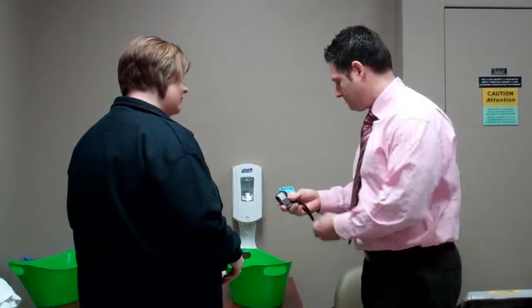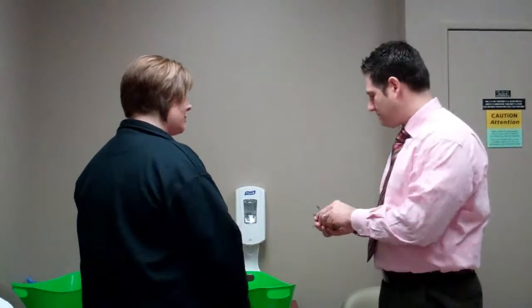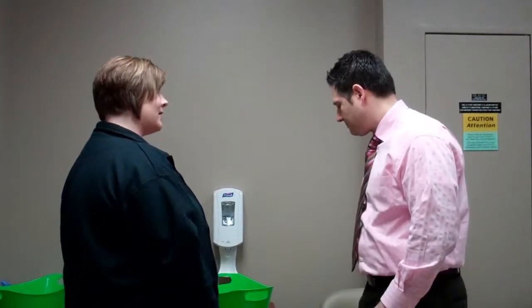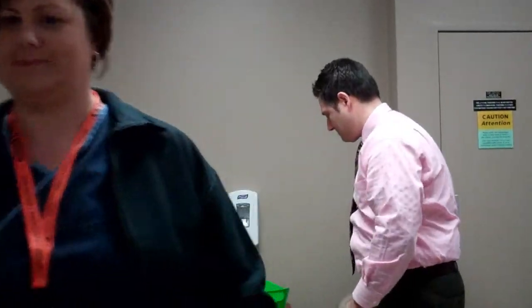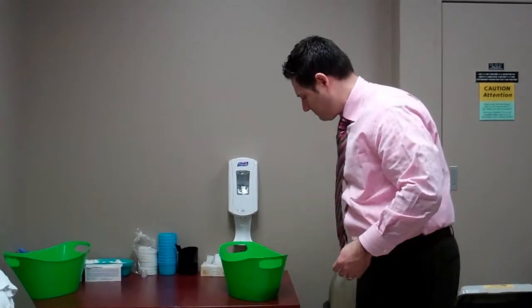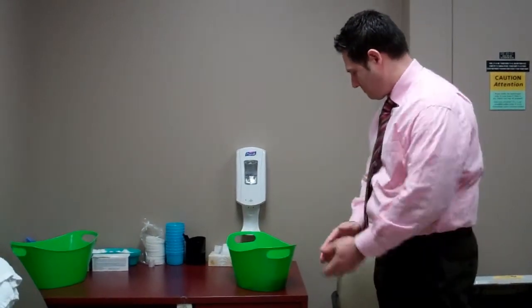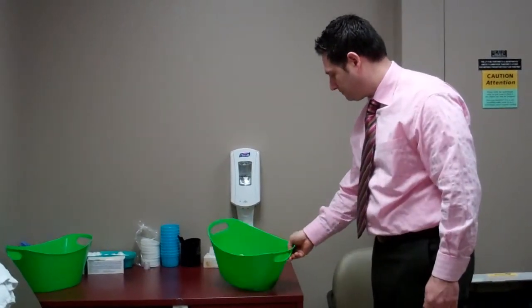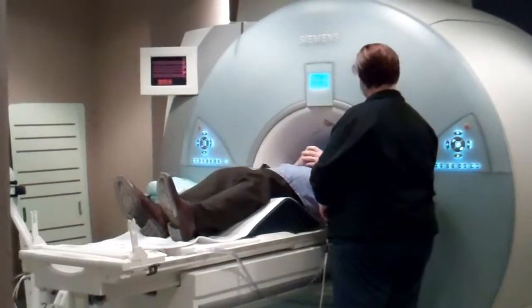After we've gone through all of that and they've asked any questions they need, we take them into the change room. If they are wearing clothing with metal on it, we have to remove all metal — it is a large magnet and we don't want any metal in the room. They are brought into the change room, all metal is removed, and a gown and housecoat are provided. All of their personal items are locked up in a locker, with the keys kept with us. From there, they are brought into the MRI room and the test is performed.